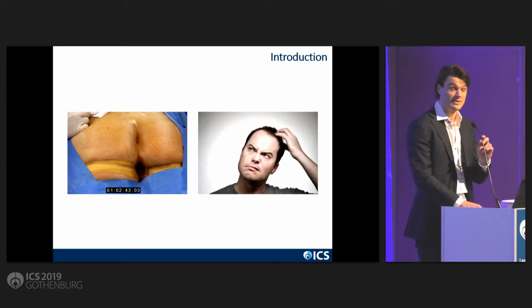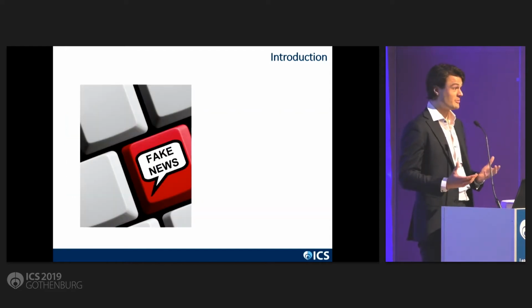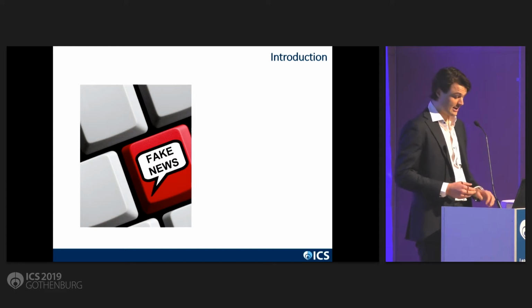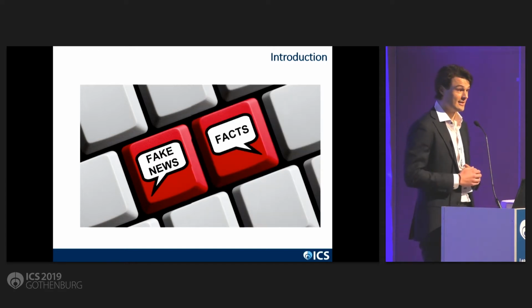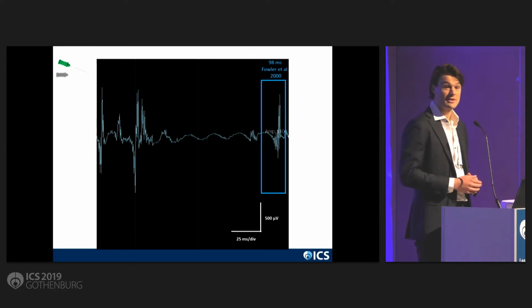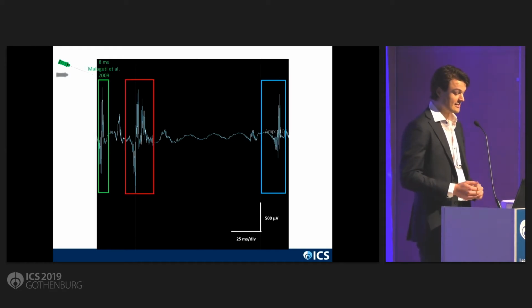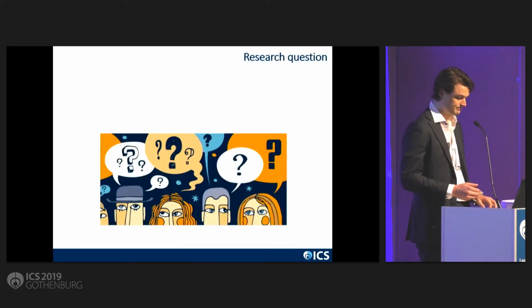Most of us can agree this is a rather subjective measurement technique. In order to obtain more objective data, one could use electromyography to detect these pelvic floor muscle contractions. This was already done by a couple of investigators who subsequently identified the presence of a polysynaptic reflex response, oligosynaptic reflex response, and direct efferent motor response.